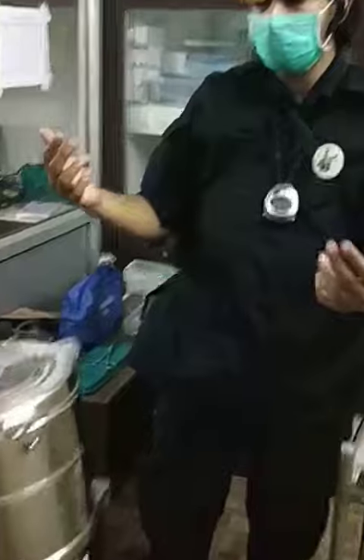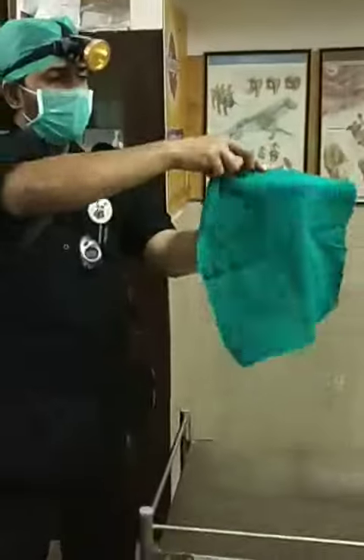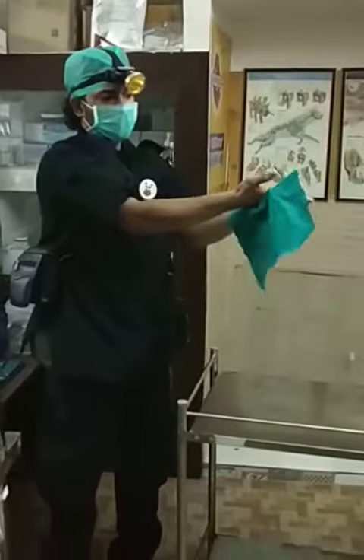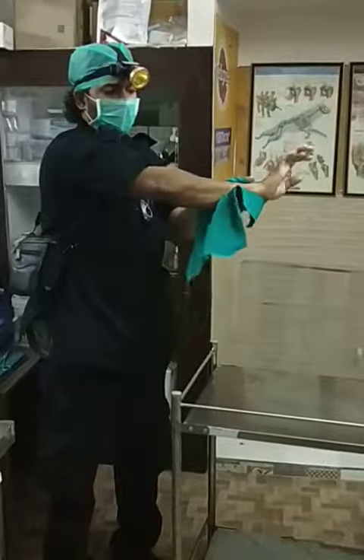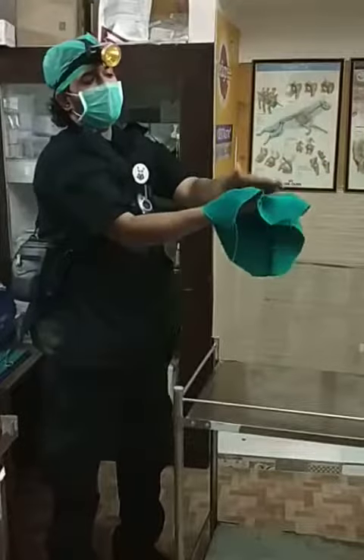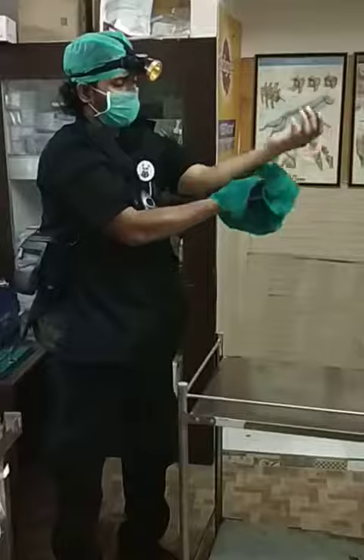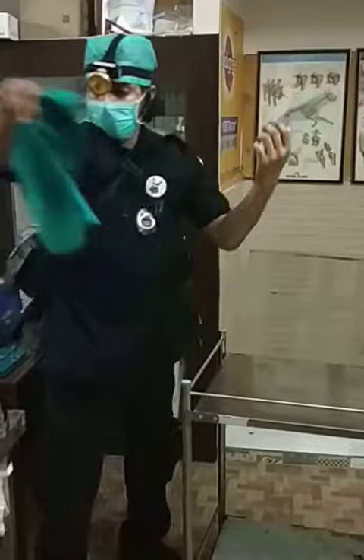I request my assistant to open up the bin please. Now I take an autoclave towel and divide it into two. You don't want to go up past your elbows, but you don't want to touch any surface twice. This is important to minimize infection — specifically, surgical site infection from the surgeon's side.